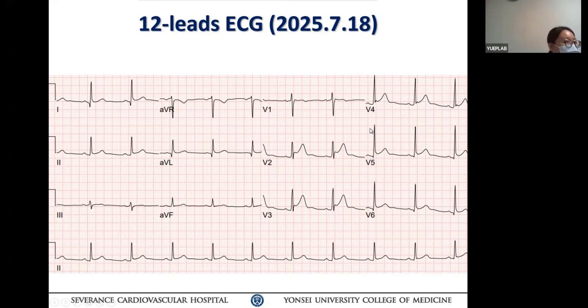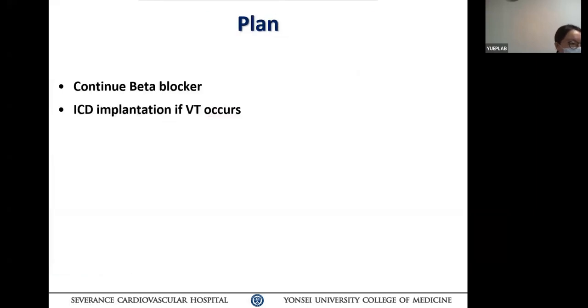And then lead 1 also has a very deep, narrow, complex Q wave. You see that in lead 1? Yeah, that's not normal. I think we need a review. Like look at the echo images carefully. Okay, I'm sure it's correct, but that's very unusual. Yes, but very interesting case.